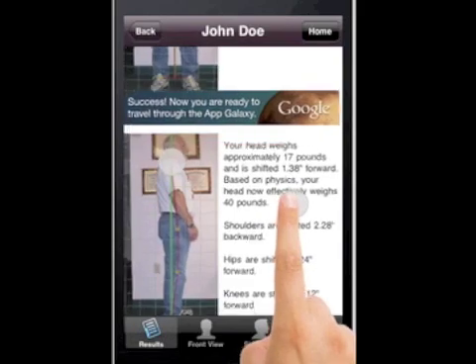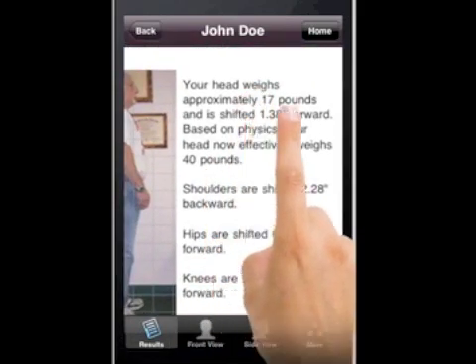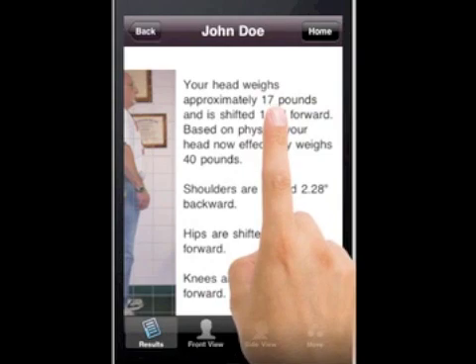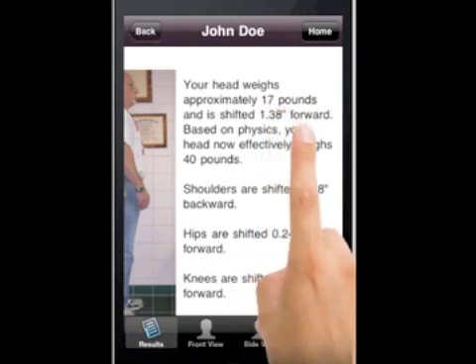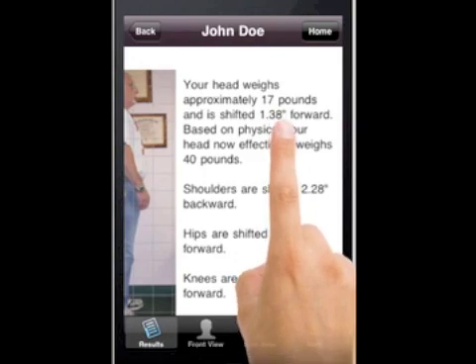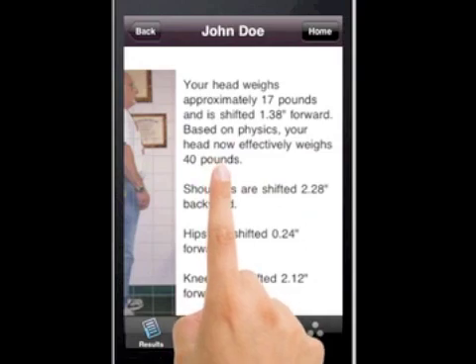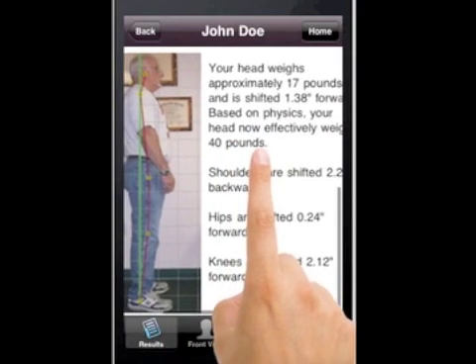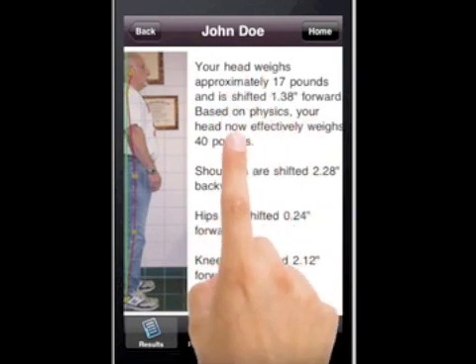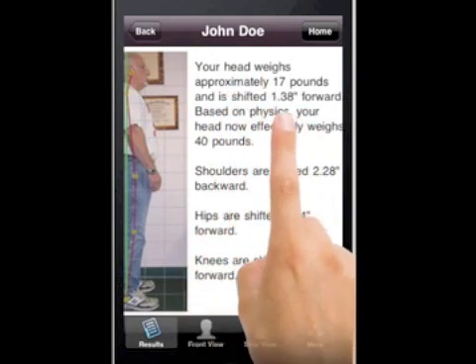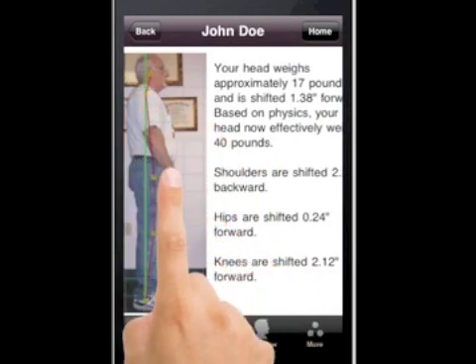The side view is really important to go over with the patient. It shows the approximate body weight relative to their head. The head weighs about 7.5% of their body mass — it's 1.38 inches forward — so the head effectively weighs about 40 pounds. This is probably one of the most useful applications of this software: approximating head weight, because these people with forward head posture usually have upper back and neck pain.